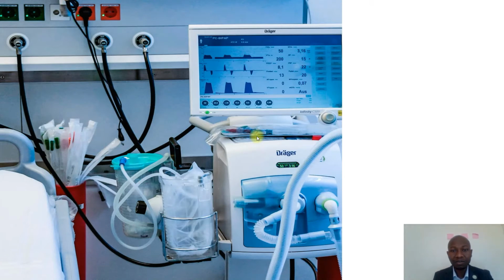However, the objective of today's video is to take you through what causes low pressure alarm and high pressure alarm. So this is the tube. These are some of the tubes. All these tubes, we refer to them as the ventilator circuit. One of these tubes is going to go straight to the patient to deliver oxygen to that patient, and then somewhere carbon dioxide will be eliminated so that the patient's cells keep adequately oxygenated.